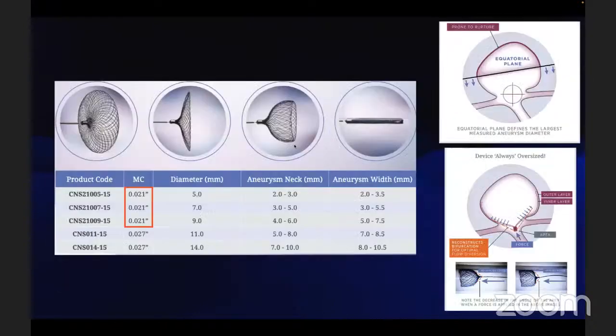Up to 9 diameter of the contour we can use the 021 microcatheter, and beyond that we have to use the 027, so we used a Neuroslider microcatheter, and we could place it without any difficulty, sir. Prior to contour placement, we have to give antiplatelet, so we used antiplatelet before that, and later on we reduced the dosage to 75 Ecosprin, which we may have to continue at least 6 weeks to 6 months, and can extend, sir.